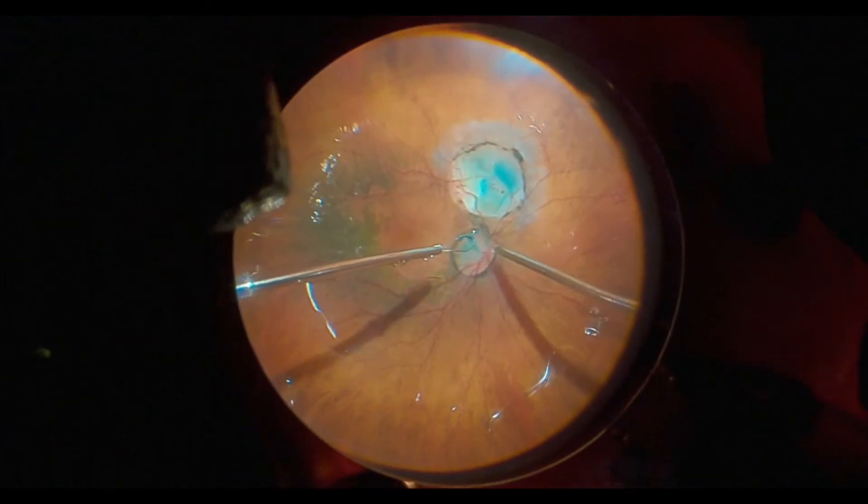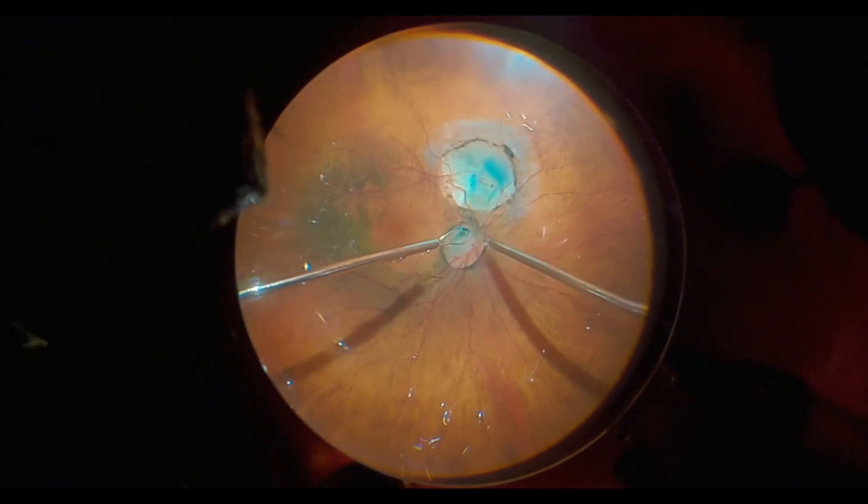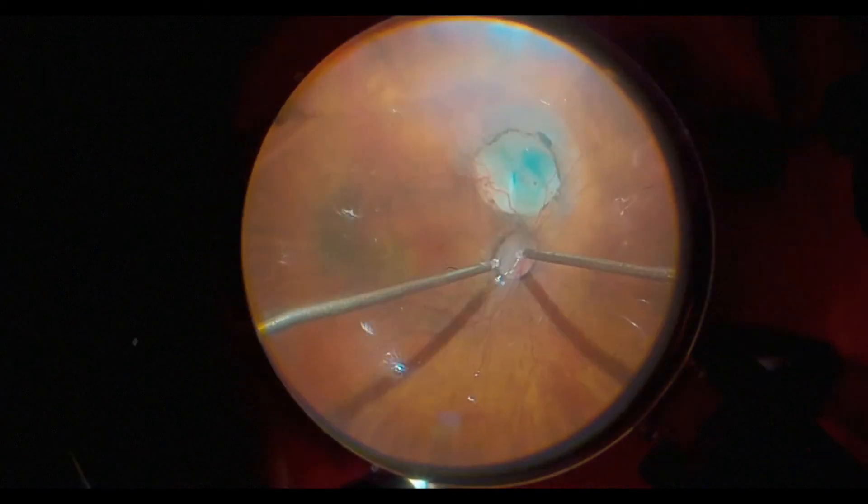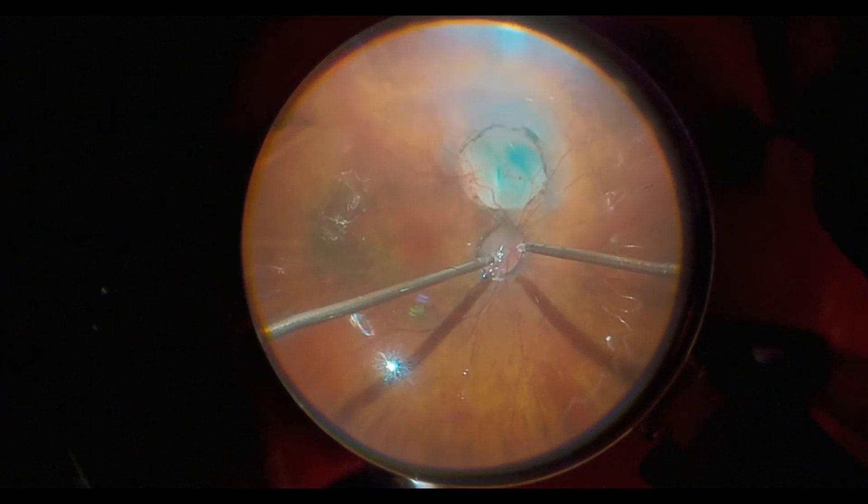Then we do an air-fluid exchange. Unfortunately, that tissue comes out during the air-fluid exchange because it's stuck to the flex loop.